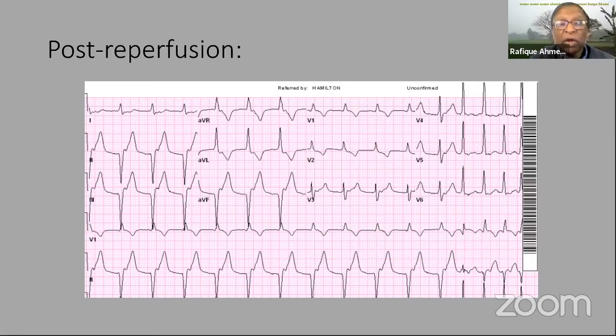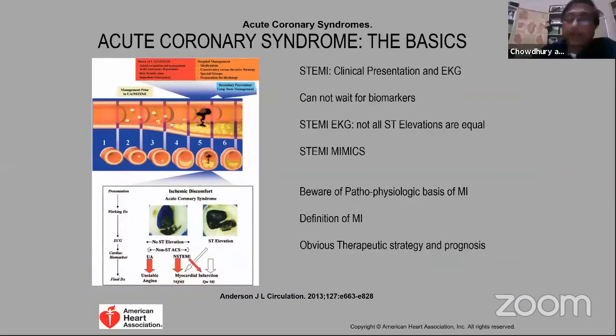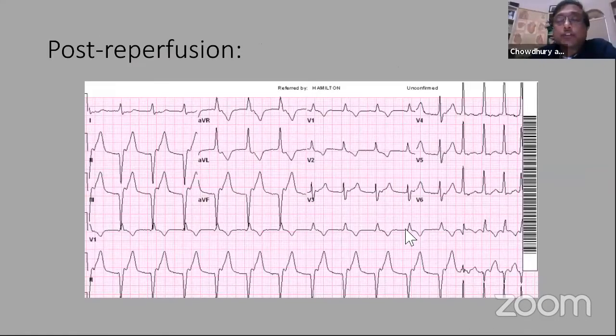This is a slow ventricular rhythm, and you can see there is a notch immediately after the QRS complex. That's a retrograde P wave, which can happen at this slow rate. Hafiz, please. Yeah. So reperfusion arrhythmias, we don't treat, and then we watch. But rarely you need some hemodynamic support if the blood pressure drops. So we proceeded with the PCI stent, and then the patient did okay.